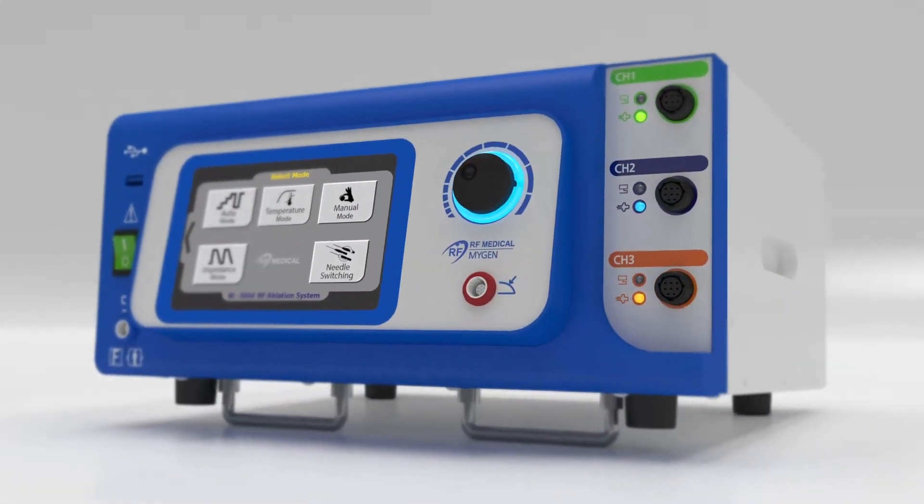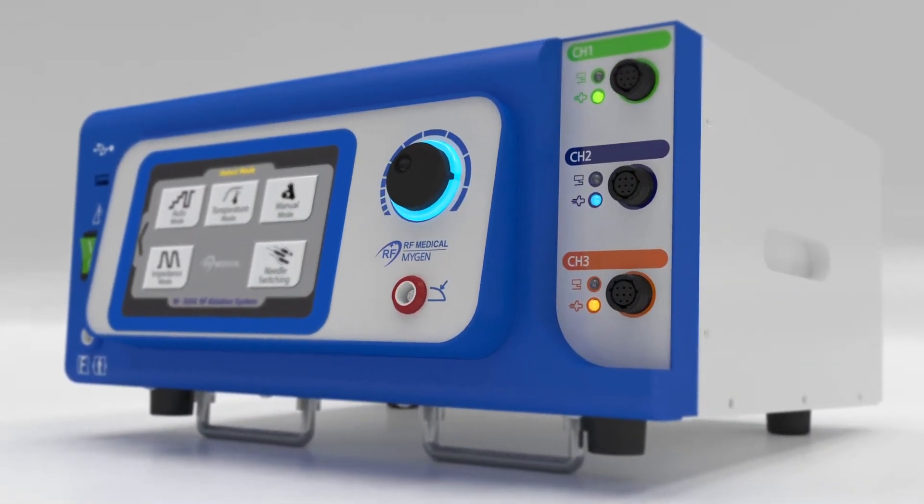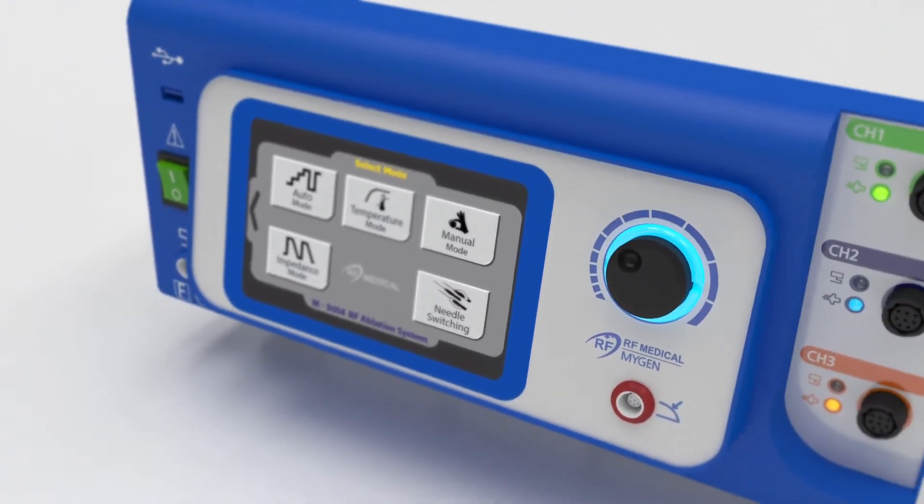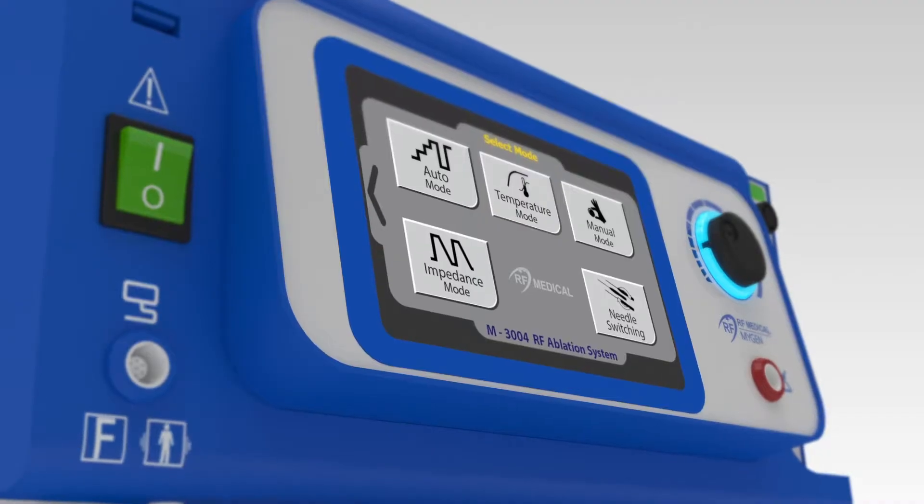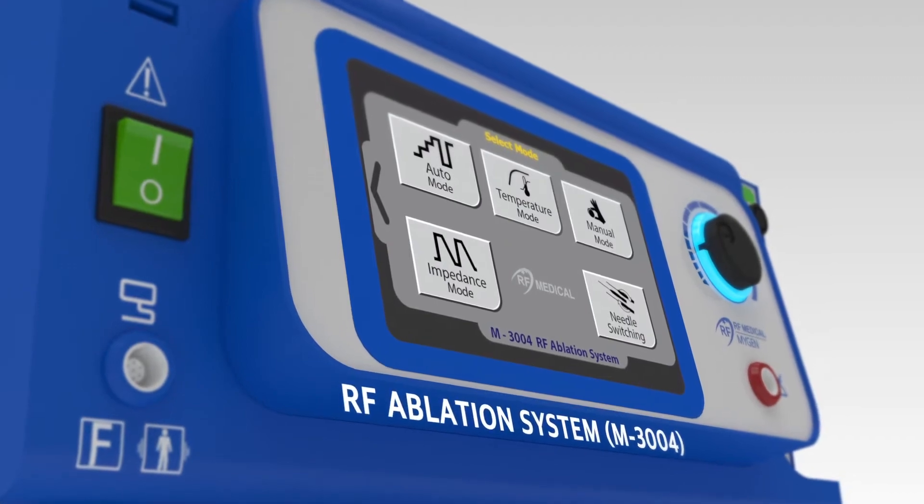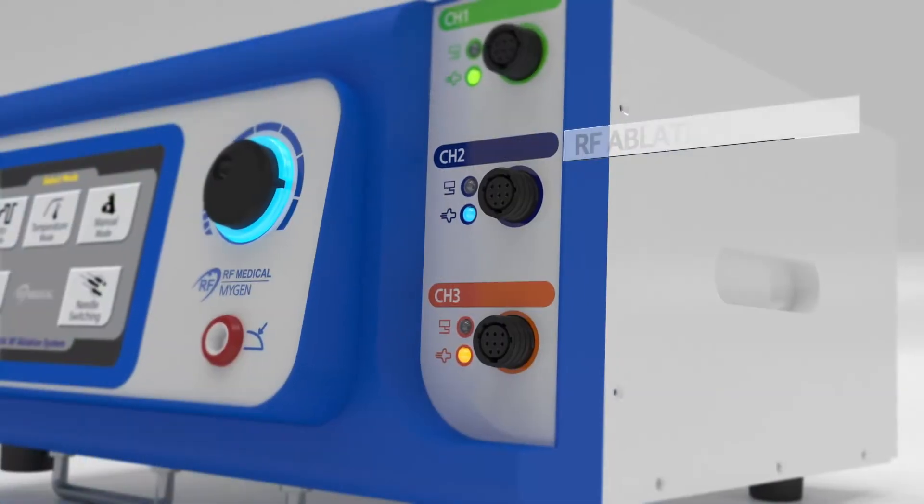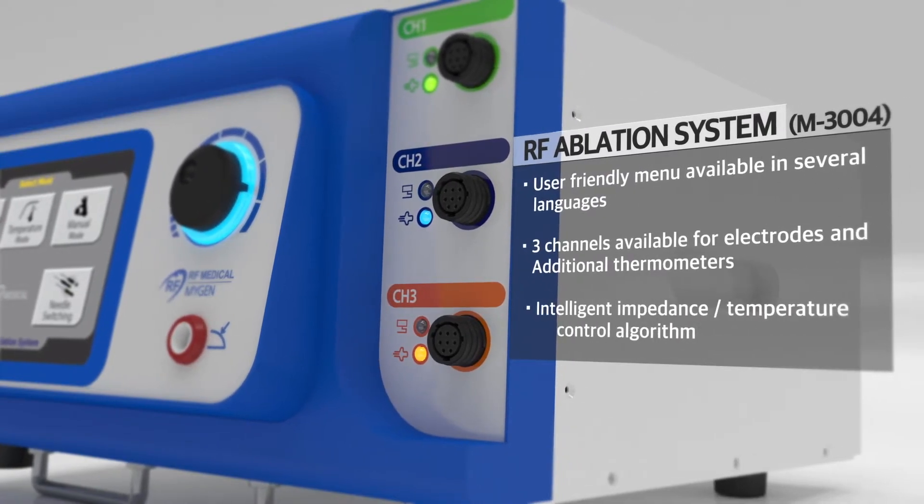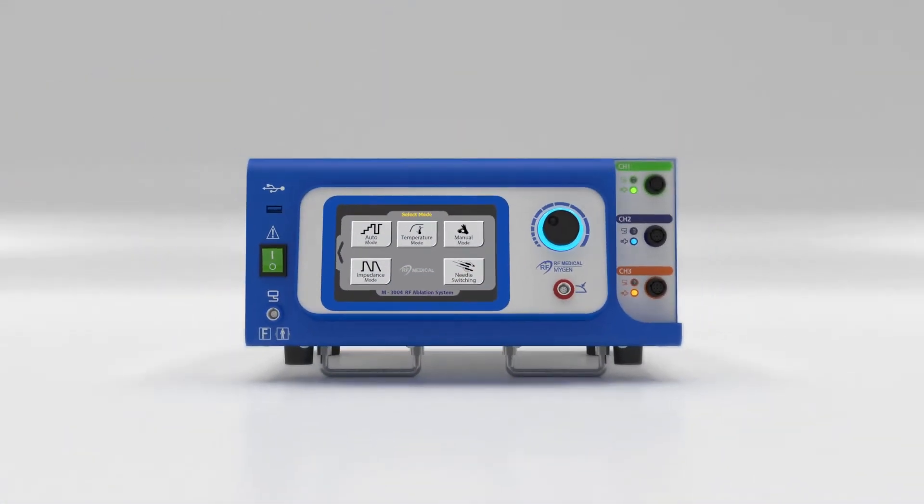Introducing our M3004 RF ablation system. Our 200-watt multifunctional M3004 generator has a user-friendly menu available in several languages, three channels available for electrodes and additional thermometers, and intelligent impedance and temperature control algorithms.